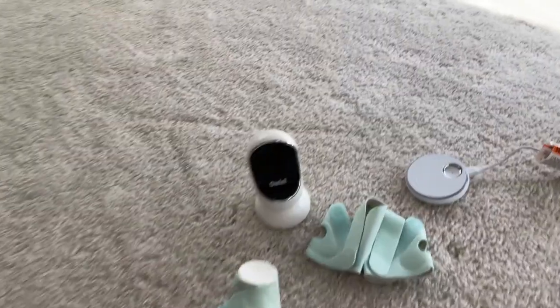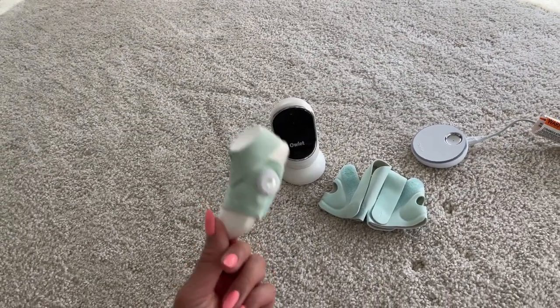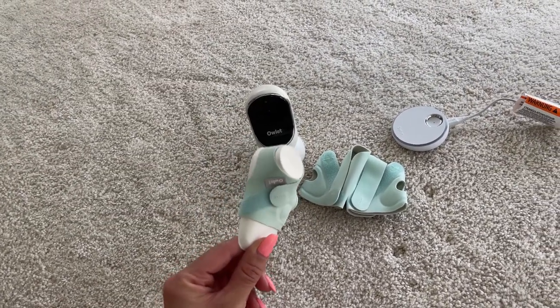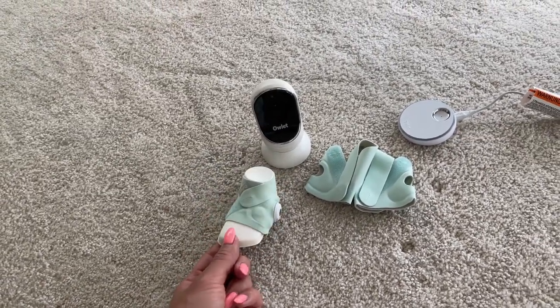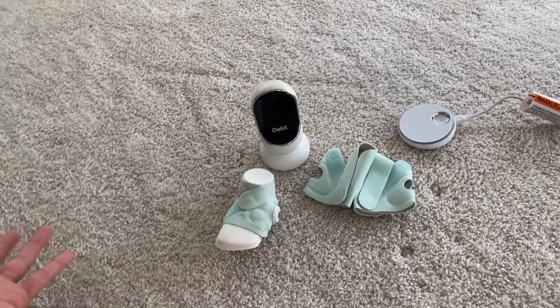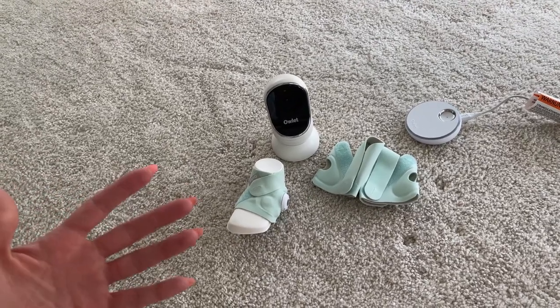At first I didn't put the dream sock in my registry — I just got the camera because I didn't think it would be needed. I saw a lot of moms talking about it and how great it is to keep track of your baby's sleep and oxygen, just to see if your baby's okay. And I was like, no, I'm not going to need it, I'm going to be fine.